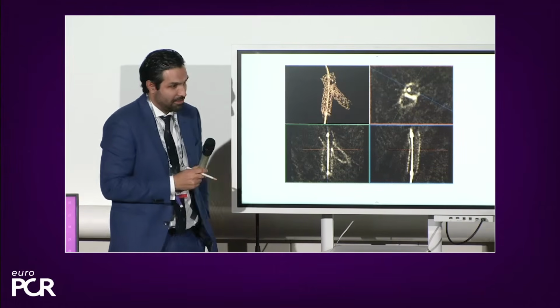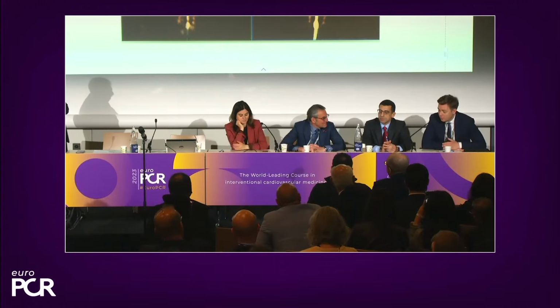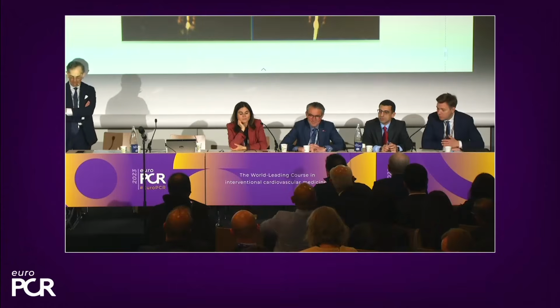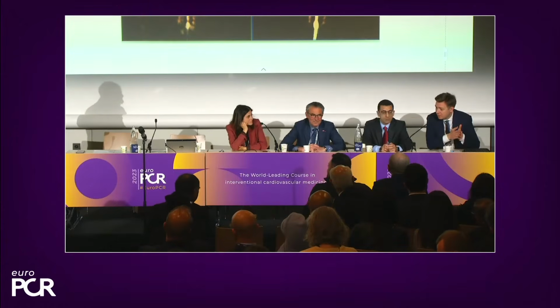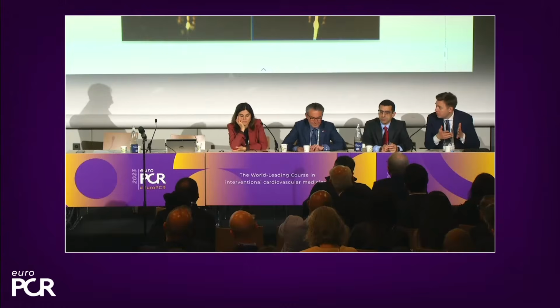I mean, it looks very promising in terms of understanding what you have done, but it would also be nice to think about it dynamically as you perform it, because there are issues from distal positioning of the wire through the struts that can be confirmed, and if that's not the case, you rewire once again, you perform the technology, and then you can confirm the position of the wire.